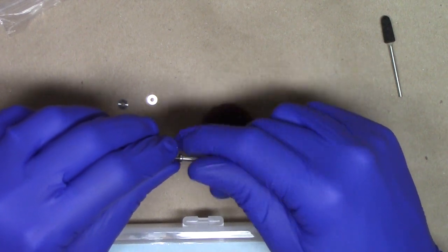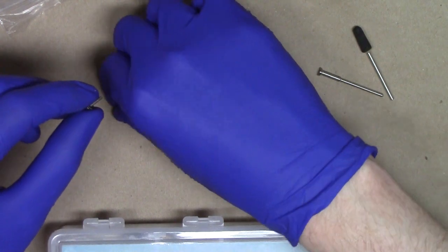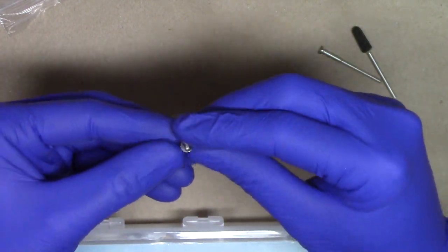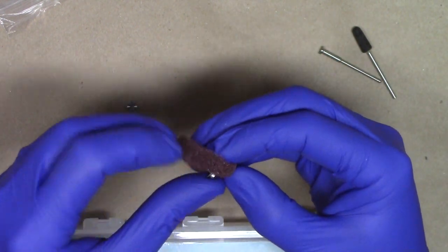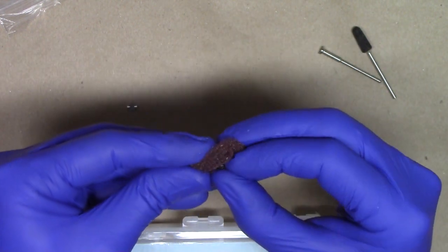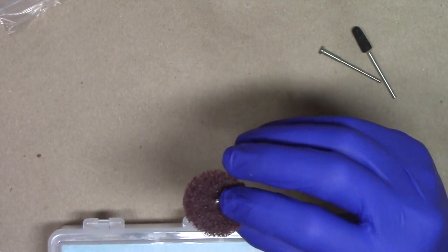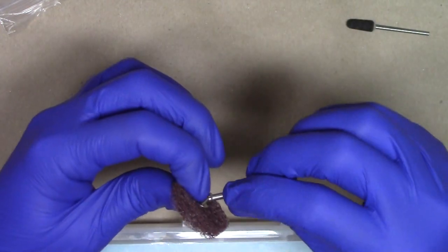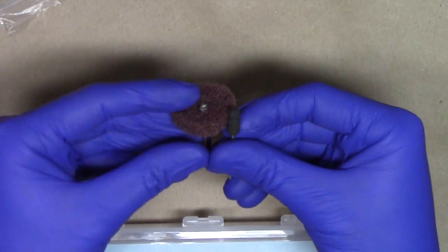I can unscrew the mandrel and put on my little ring, placing the ring on one side or the washer, and now just going right through the center of this little finishing wheel. Sometimes you have to push kind of hard. Taking our other ring, putting it onto the end, and then tightening down our mandrel until it's finger snug. So I'm going to put these two aside for now.